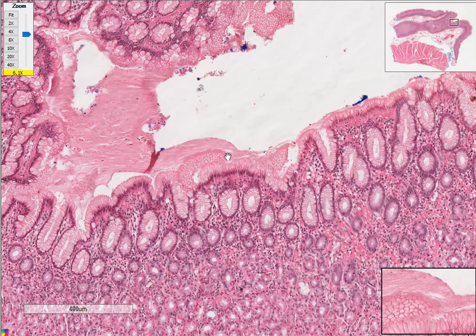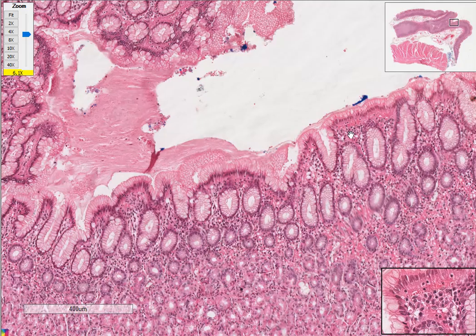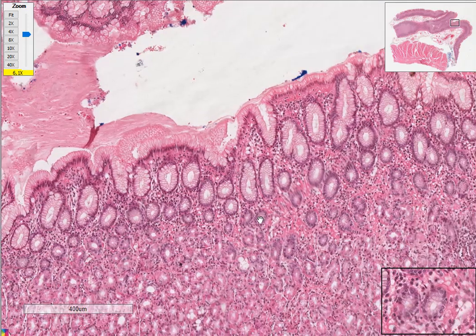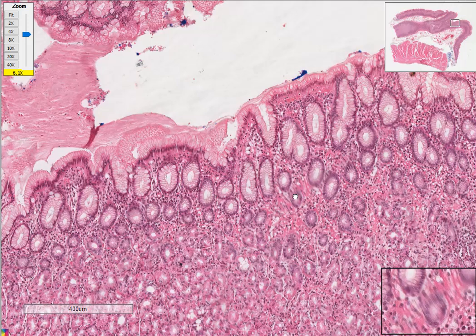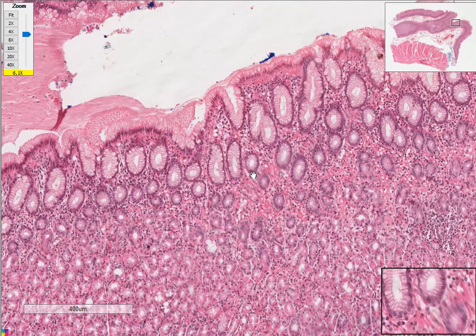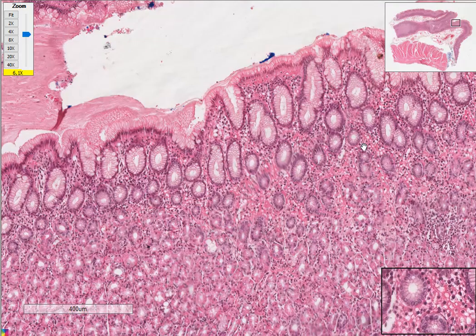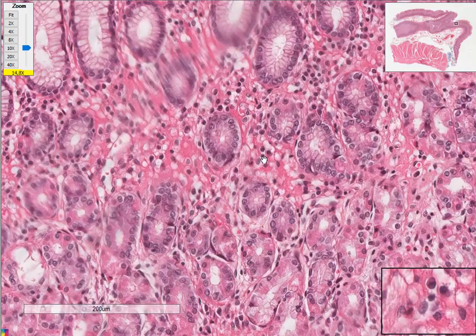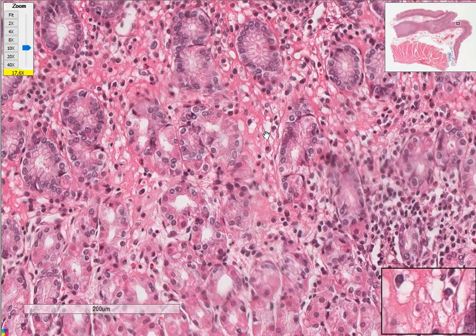So the function of the surface mucus cells is to maintain and protect the stomach lining from the acid that the specialized gastric epithelial cells produce. And then the lamina propria, you can see this is the lamina propria here, the spaces between the gastric pits, with multiple lymphoid tissue cells. There are lymphocytes here, which is normal, and you get to see them in normal stomach histology slides.